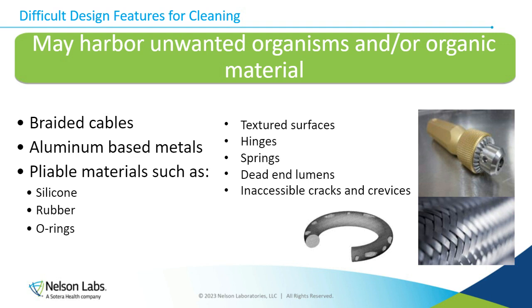Dead end lumens, no device should have a dead end lumen. You have to have a way of cleaning through, right? I can flush all you want, but once it's stuck at the end of that barrel, I'm not going to be able to pull that off, no matter how many brushing steps I have. So these are some of the things that have caused problems before in cleaning, but they're not avoidable. We need these in there to function, so it is important to have them.